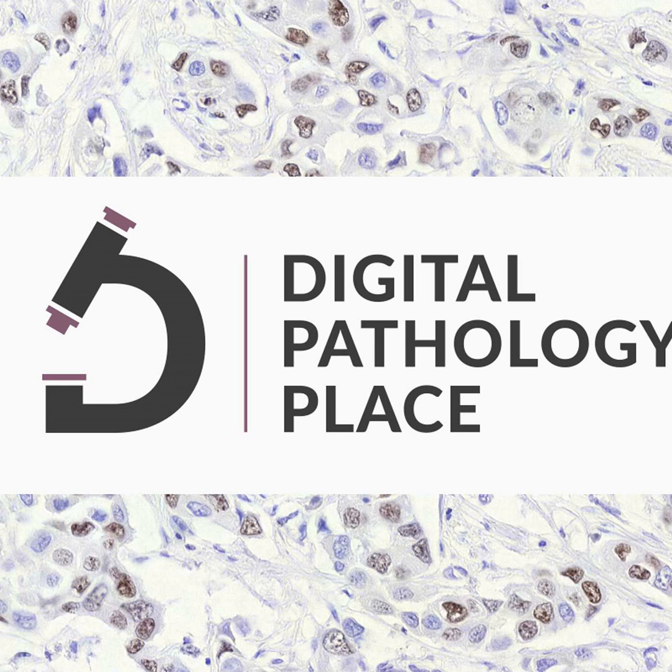2. Tissue image analysis. A. Introduction to tissue image analysis. Tissue image analysis is an integral component of digital pathology, serving as the interpreter of the vast amounts of data contained within digital images of tissue samples. This process involves applying computer vision algorithms to translate visual data into quantifiable measures. By doing so, we can extract, organize, and analyze a wealth of intricate details that could otherwise be overlooked or inconsistently interpreted by the human eye. This, in turn, enhances the precision and reliability of diagnostic and research outputs.